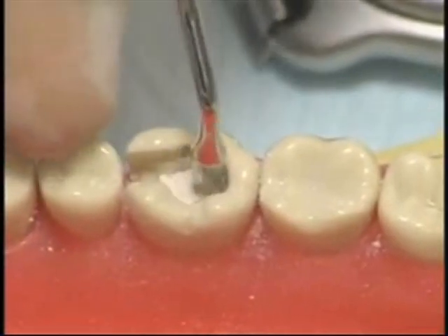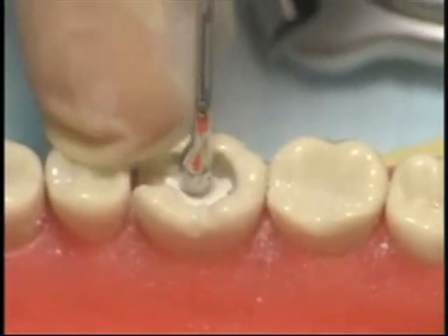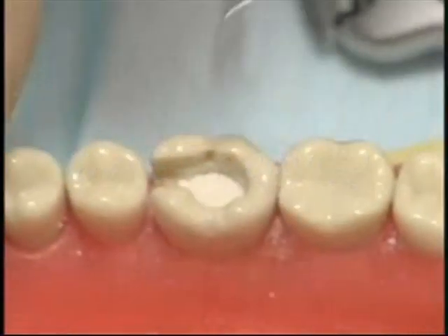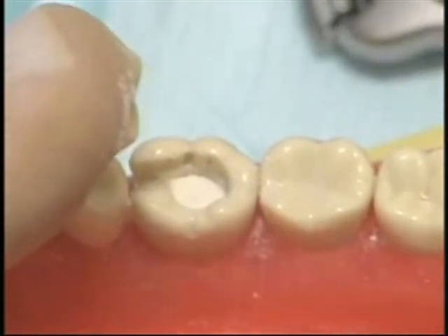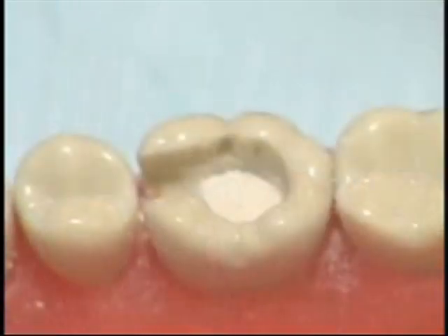Take special care not to contaminate the wall of the cavity. If there is any excess cement, carefully remove it using a spoon excavator. This is the completed procedure for placement of zinc phosphate cement into the prepared cavity.